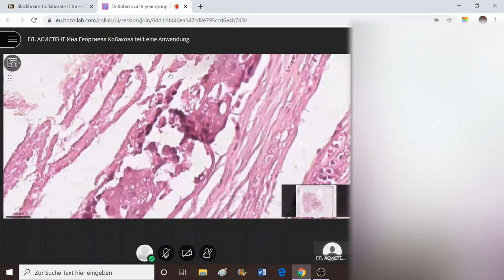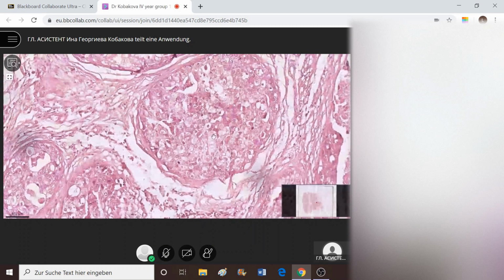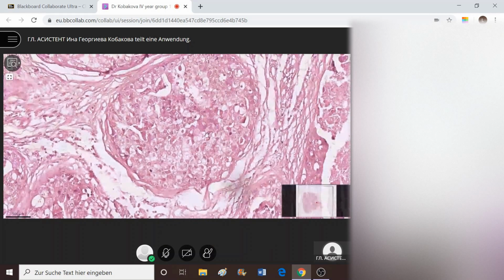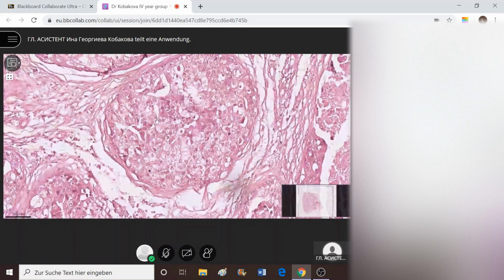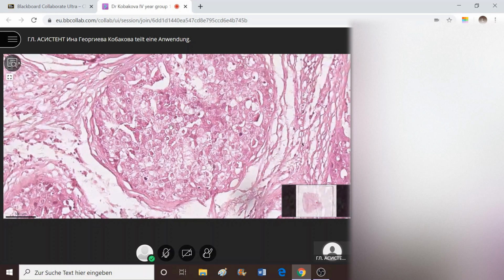There you go. Now you see a cluster of cells which are having two specific types of morphology. That would be the ones with foamy cytoplasm and centrally positioned nucleus, and some with more dispersed chromatin and more pinkish cytoplasm. These are actually generated from the myoepithelial and the epithelial cells. So that's how we recognize it. We won't see any normal structures here.